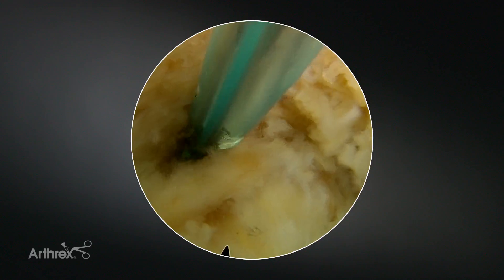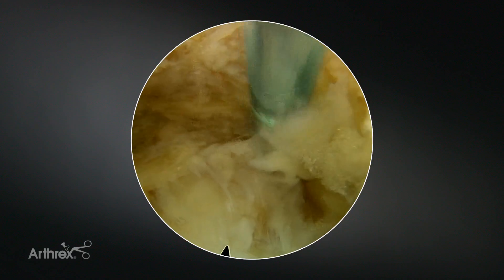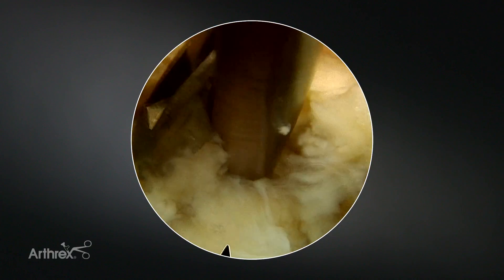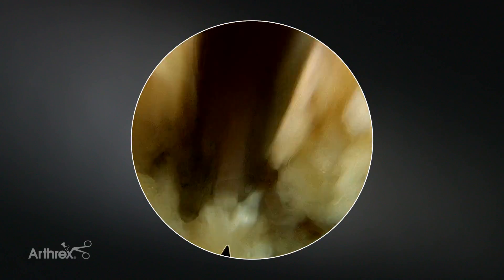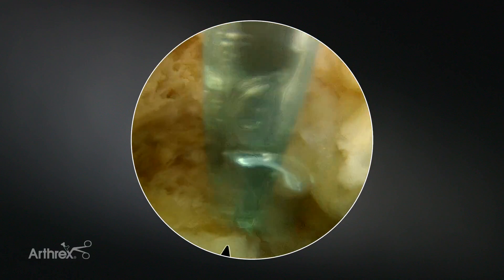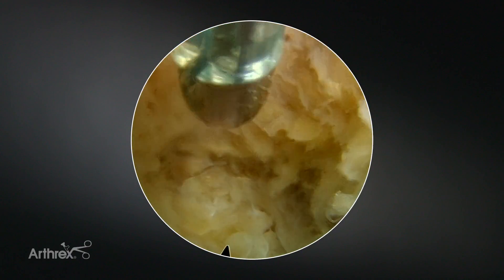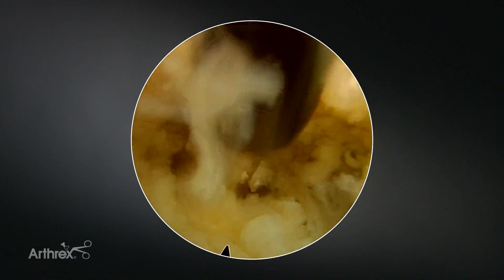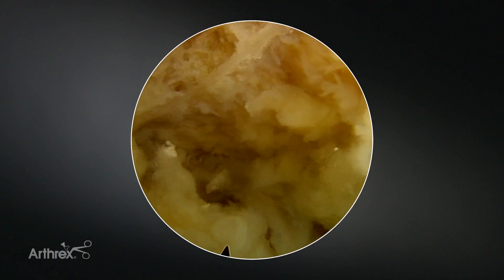This is the floor of the canal at L5, and this is the floor of the canal at L4. There is a bit of a disc protrusion here — this is the top of the disc. Now we're going to use the biter to cut the fibers of the annulus — you can push it in and cut some of the fibers. This will allow access to the sub-annular space. The loose fragments of annulus can be bipolared, and these loose bits will shrink right down if you hit them with the bipolar to give you a nice space to work. Now here we're actually going into the disc and grabbing some disc material, some sub-annular material.